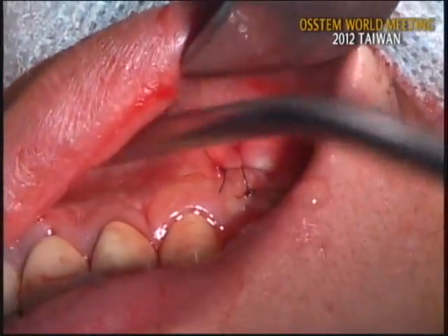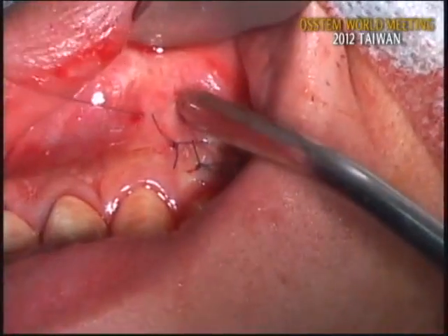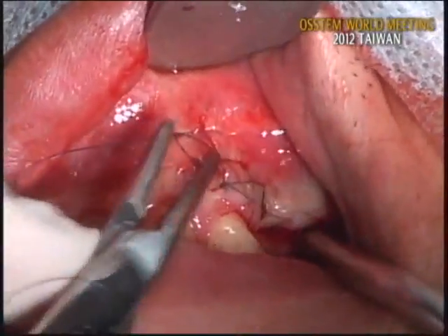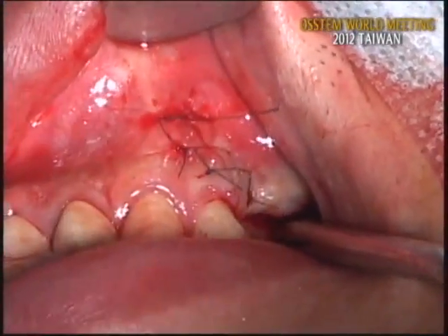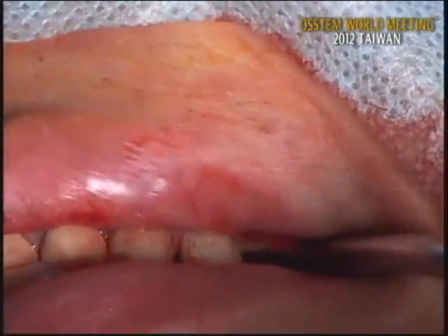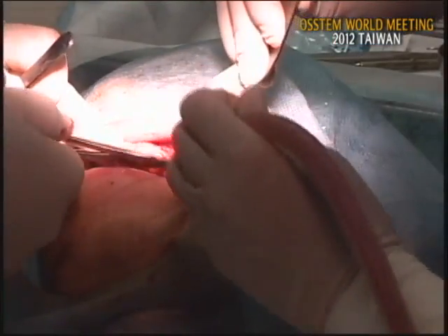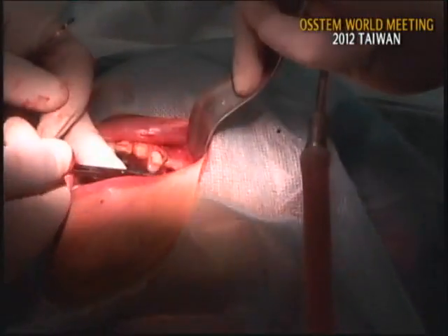In fact, the lateral window approach sinus bone graft requires many steps and relatively advanced surgical skills. Not only the lateral window opening, it requires multiple skills. So just the LAS-KIT, we cannot do lateral window approach. But the LAS-KIT is a nice tool for safe access to the membrane. Especially beginners worry about the tearing of the membrane during the osteotomy. The LAS-KIT will help safe window opening.